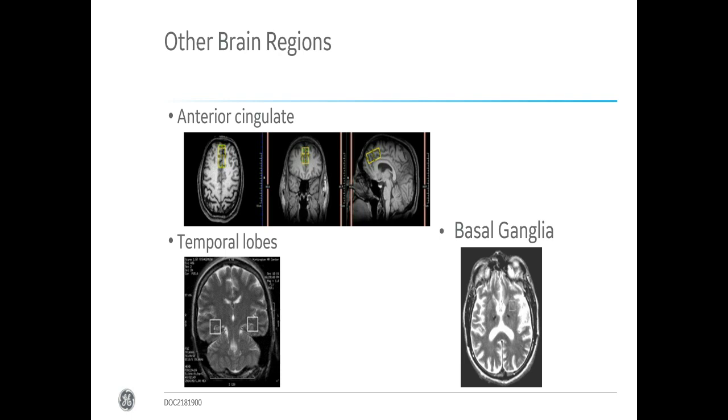It's interesting in a lot of psychiatric disorders, so that's the reason why people are interested in it. So it's more used in clinical studies, therefore. As I mentioned before, with psychiatric disorders, it's more on the group level that we today analyze our spectra.